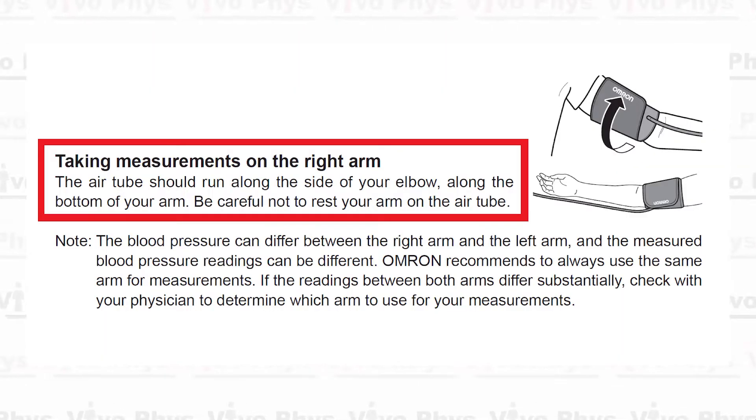If you're going to use your right arm you need to make sure that you align the cuff in a different way so that it's properly covering the brachial artery with the air bladder in the cuff. To quote the Omron manual, the air tube should run along the side of your elbow along the bottom of your arm and be careful not to rest your arm on the air tube. The reason for that is because you don't want to pinch the air tube by accident.